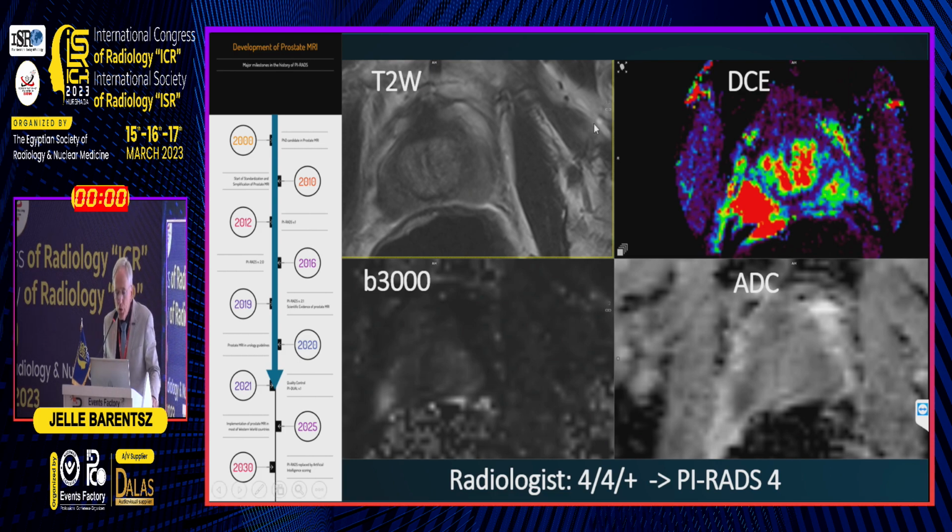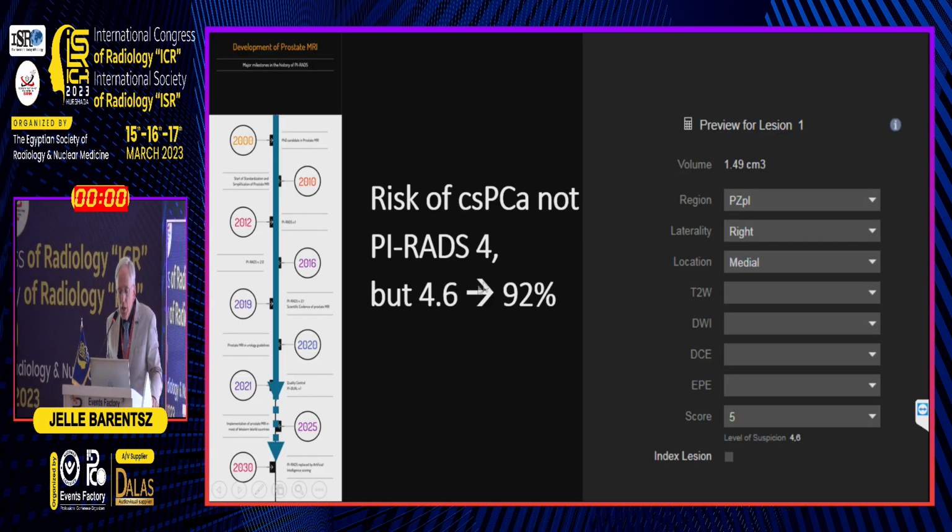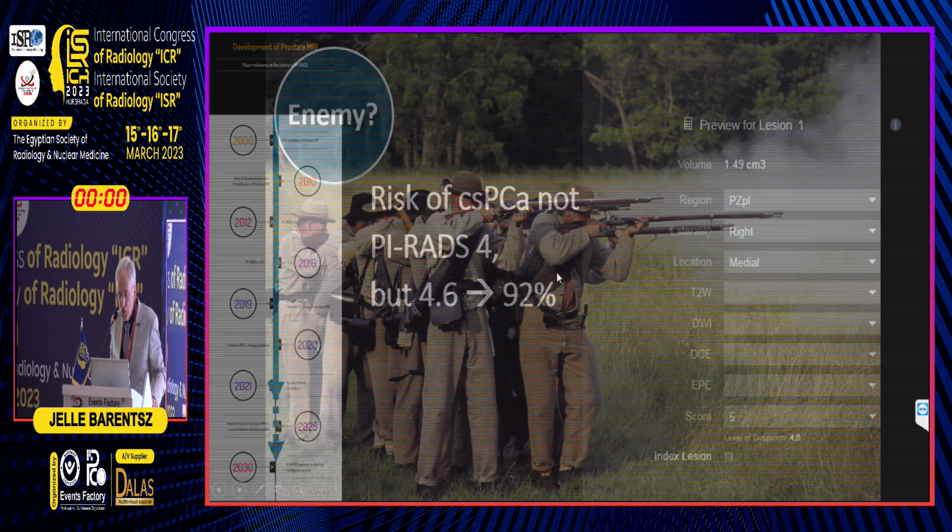What will be the future? This is a clear PI-RADS 4 lesion. Focal abnormal, plus contrast, white on B3000, black on ADC. Well, this is PI-RADS 4. However, if you ask the computer, you'll get the following data. It gives you a probability in percentages that it will be a significant cancer. So this is not a PI-RADS 4, but in the future, in 2030, I think we will leave PI-RADS and we will have the AI percentage mapping, a probability map in percentages.